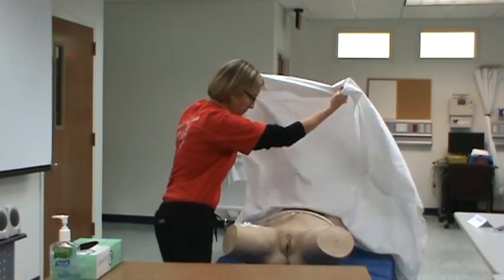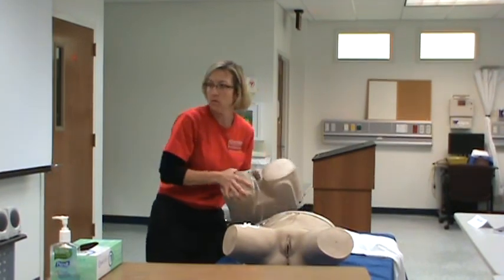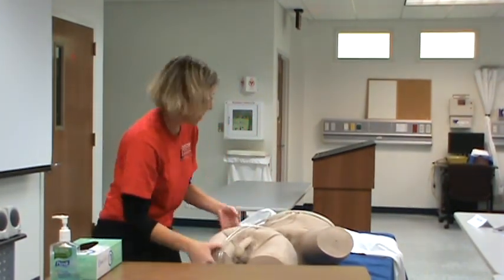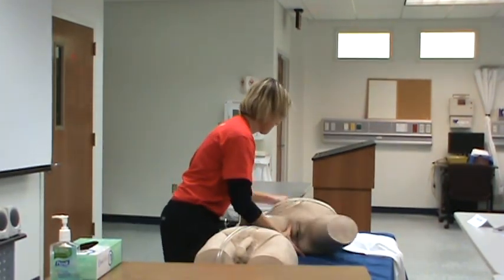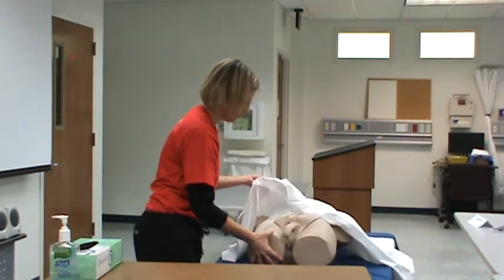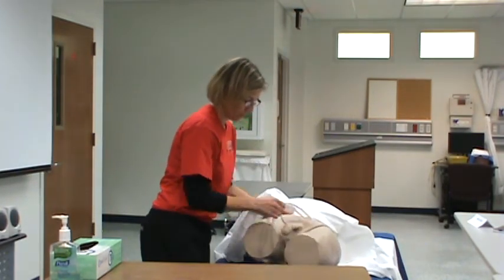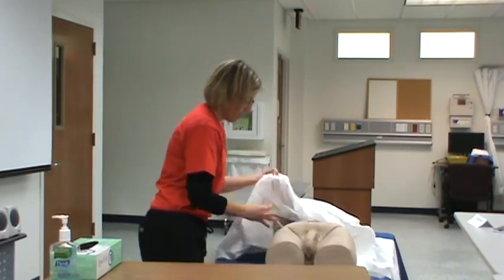Now let's take a peek at how much these bags hold here. I think they hold usually 2, right? Yeah, 2,000, that's what I thought. 2 liters per bag. So usually it's emptied once a shift. So you shouldn't have a full bag for a shift.